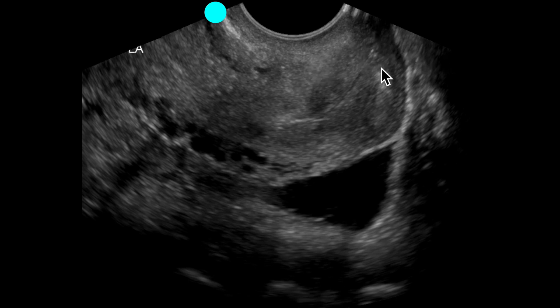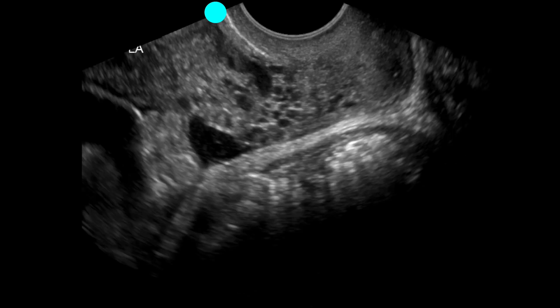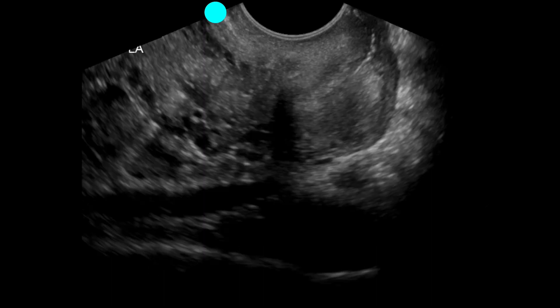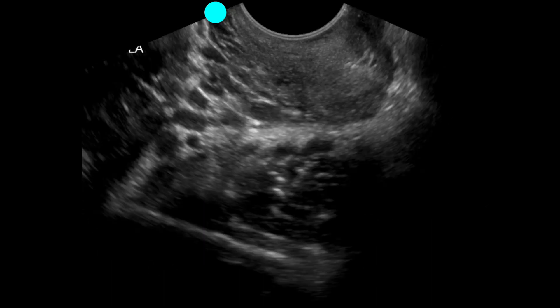We haven't fully explored the cervix yet. To get the cervix into view — this structure up here — we need to angle more inferiorly. As we do that, we notice a pocket of free fluid. Moving along, it continues through the area; it appears simple with no internal echoes. We continue through the cervix.